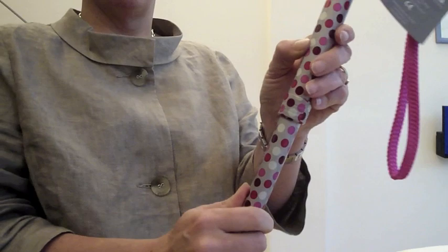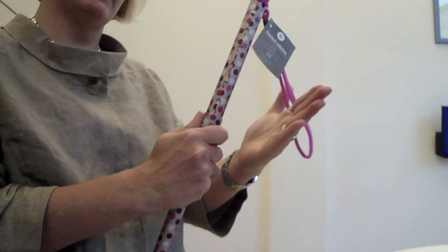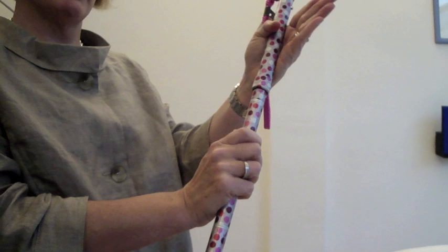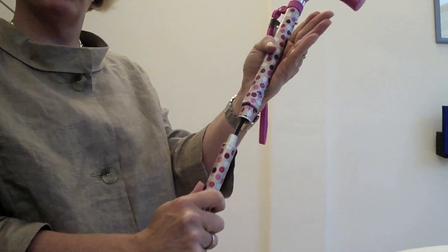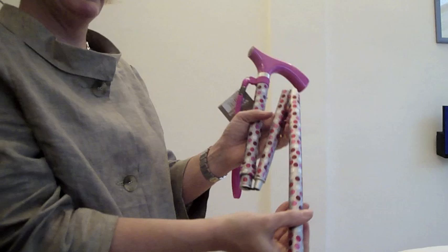To fold the stick — you don't have to put it back up to fold it, but I'm just going to show you. Being right-handed, I put the stick top in my left hand. I give the first section a small turn at the same time as pulling it apart — it's just like a tent pole — and feed it into my left hand. Then I take the next section, again a small turn, pull it apart, feed it into your hand.